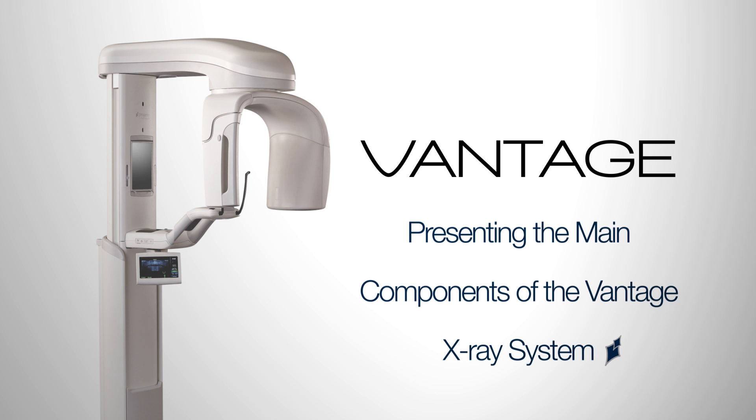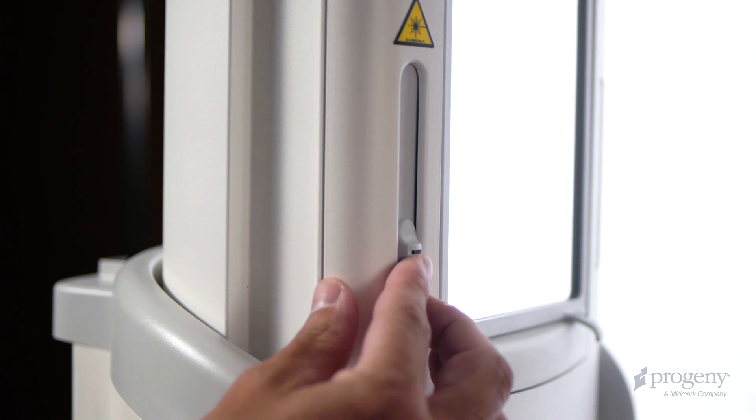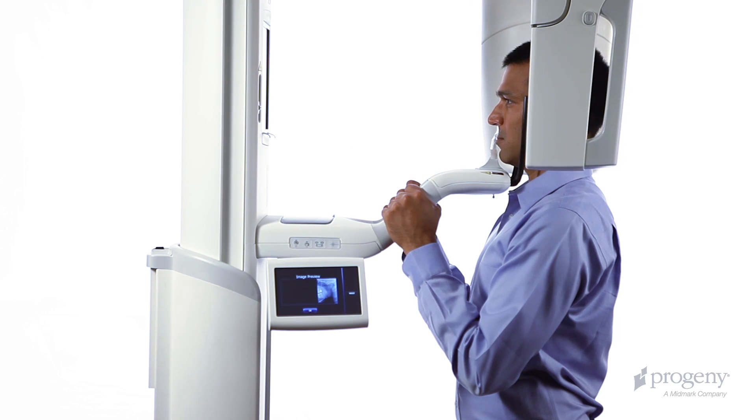We present the main components of the Vantage panoramic x-ray system. On the vertical column beside the alignment mirror, we have the adjustable Frankfurt plane laser, the rotating overhead support and C-arm, and the temple support wands.